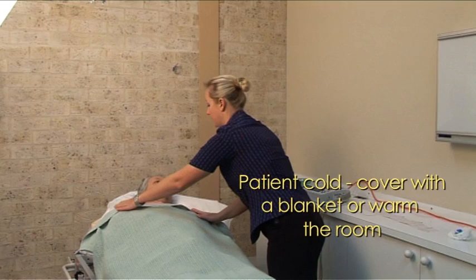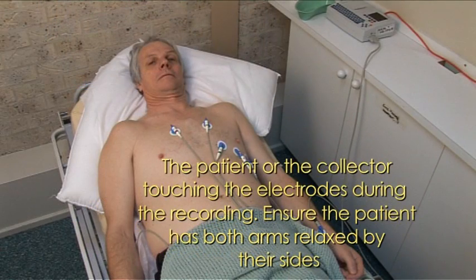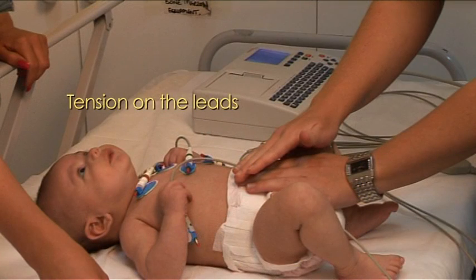The patient must lie on a comfortable bed large enough to support the entire body. They must be completely relaxed, and this can be achieved by a thorough explanation of the procedure to relieve any fears or apprehension they may be experiencing.